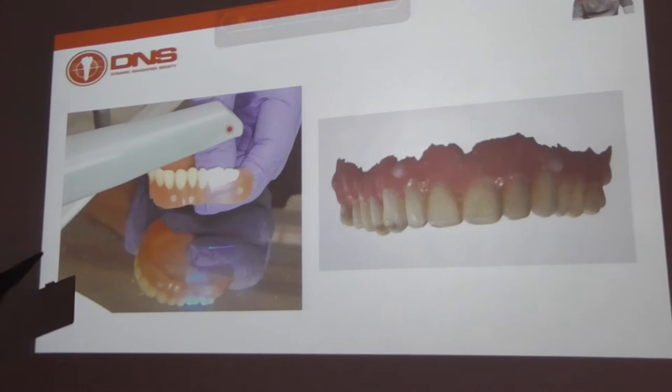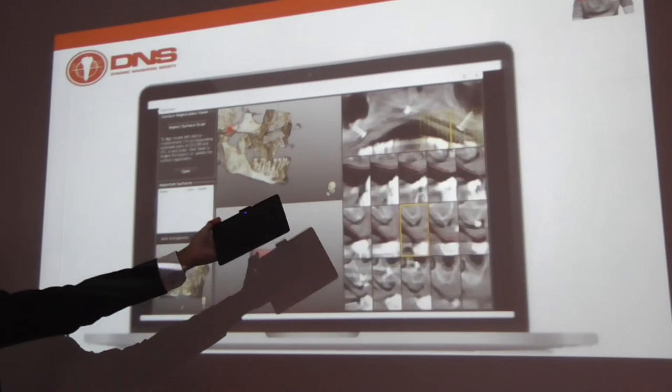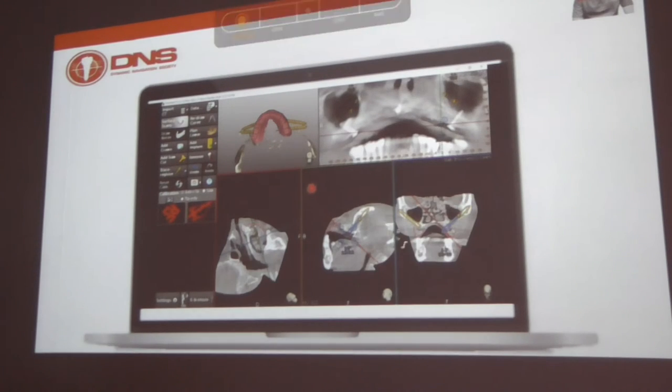Then I always scan the denture, like I said, top and bottom, to create an STL for which I would do the overlap. This is how I do the overlap. It's a simple, straightforward technique. We use minimum 3 points. If 4 or 5, better. Then I would check it along the path to make sure that my overlap is correct. So when you check the roof too? Yes. Okay. Yes. And then I would go for the abutment planning.